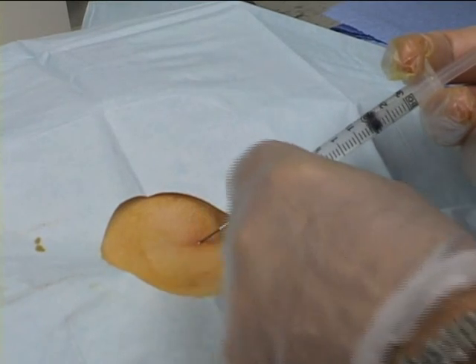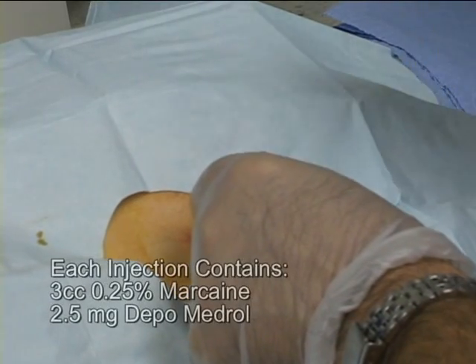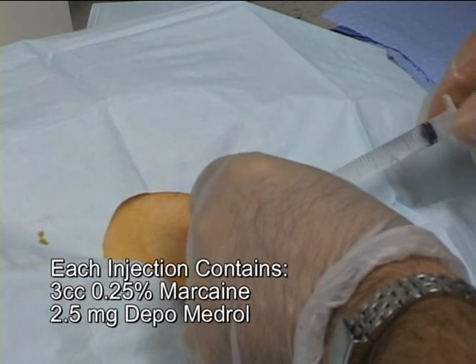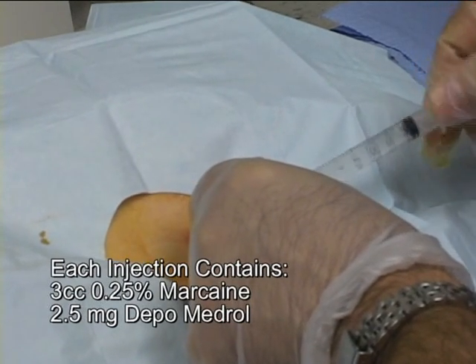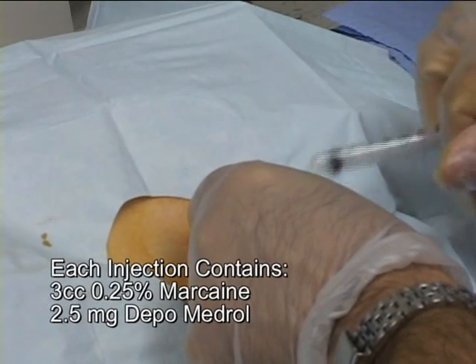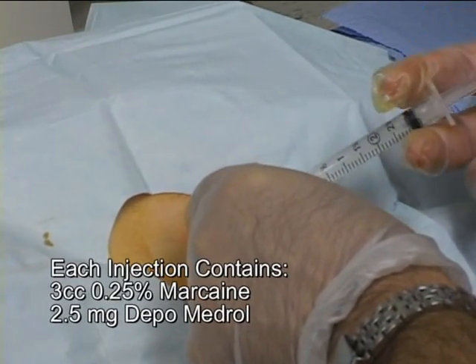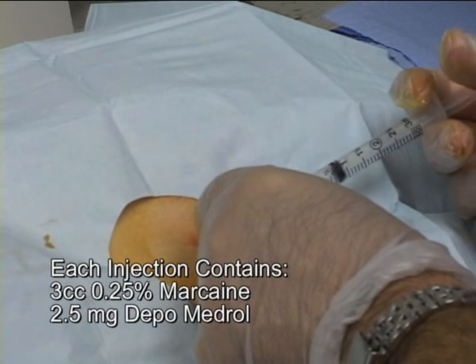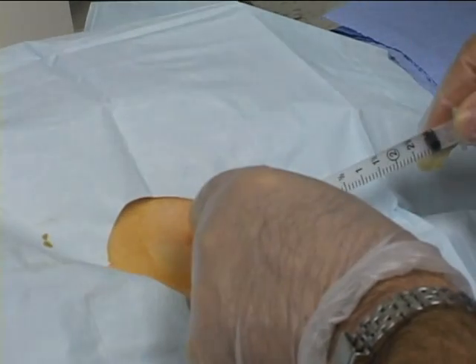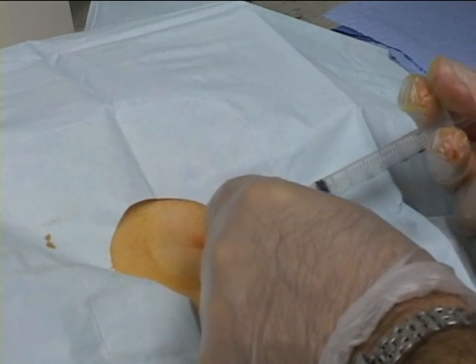We inject 3 cc's of 0.25% Marcaine with each syringe, and this floods the tailbone and sacral area. We repeat this, this is 3. Repeat these injections up to 6 times.